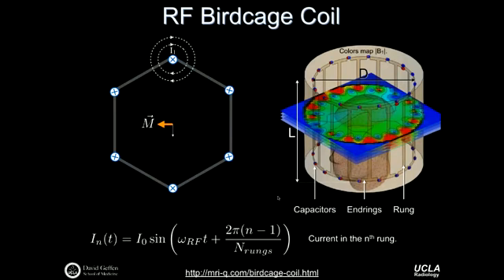And the capacitors tune it to be close so that this birdcage coil resonates near the Larmor frequency, meaning we can put current into the system, and those currents will oscillate with frequencies that are important to us and, importantly, tuned to oscillate at the Larmor frequency.